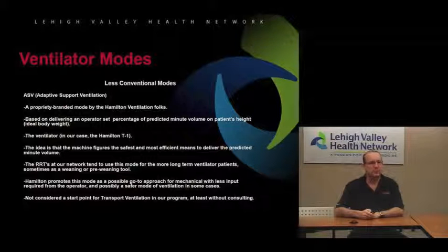Speaking to the respiratory therapists here at Lehigh, so far at least, they mostly use it as a weaning tool or a pre-weaning tool, or for some of the more long-term ventilator patients that they just can't seem to get off, like the ones that they are only setting inspiratory pressure and CPAP pressures for. Maybe they go to this ASV mode for their long-term patients, or, like I mentioned, as a weaning tool.